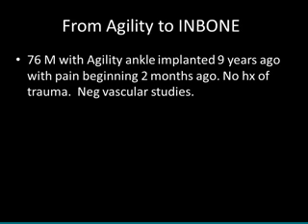And the next big one, and something we can do something about, is there was a 15% failure rate for technical errors. And those are the errors that those of us who have done total ankles have made. And so we're trying to learn more, and that's the benefit of these webinars, to try and increase our technical experience so there are fewer failures.